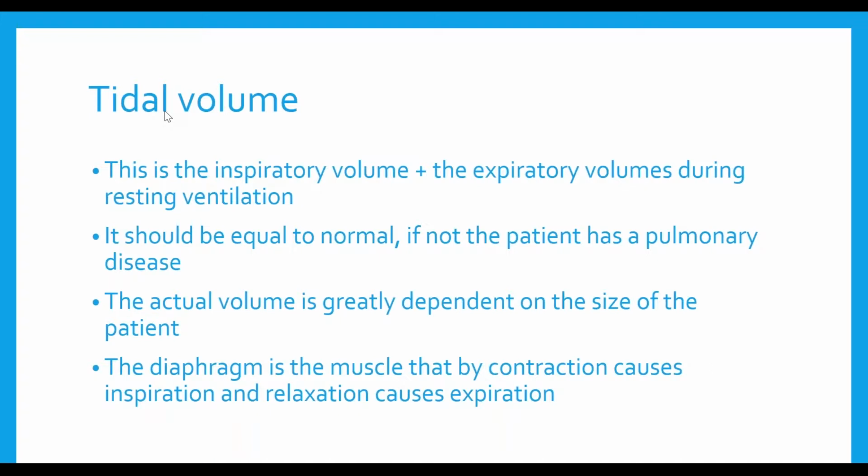You can also see the rate pretty easily, particularly if you graph it out. You can calculate the rate as well. The digital displays don't necessarily give you the rate all that well, or most of the ones I've played with. They just give you the volume, but they don't give you the rate.